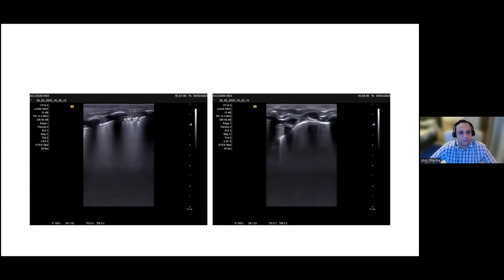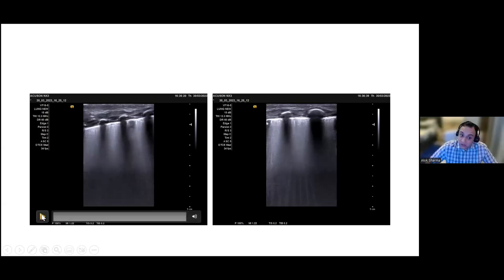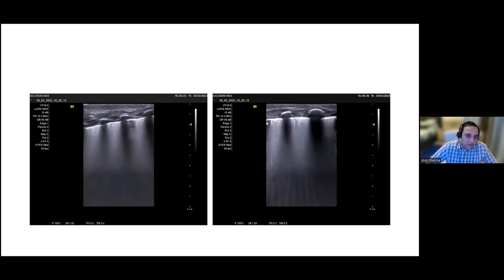So just what my concern was, this image I showed to you, if it's an artifact or we can consider it a shred sign or a fractal sign. It's not a shred sign. It's not a fractal sign. It's just not irregular enough. The pleura at the level looks relatively thick and intact. There's sliding. Usually with shred sign, you'll have a very thin rim of parietal pleura with the visceral pleura completely dragged back, a very irregular margin for the deeper pleural layer.